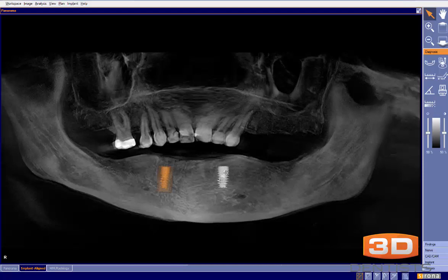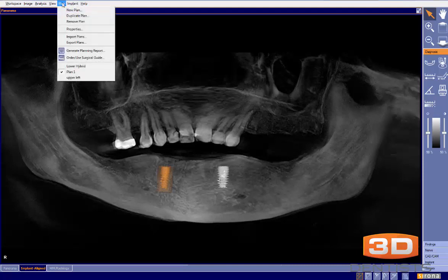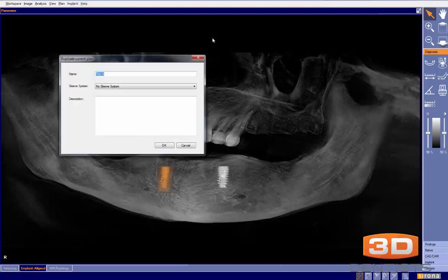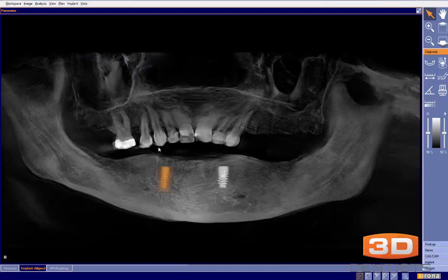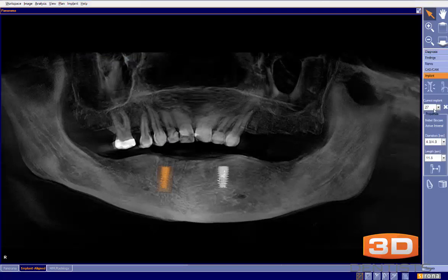Once I've planned these out and I'm ready to do the next option — a fixed hybrid — I'll simply come up here to 'Plan,' select 'Duplicate,' and name this plan 'Lower All-on-Four.' Then I click OK, and it keeps those implants in place so I can come in and add the additional implants.